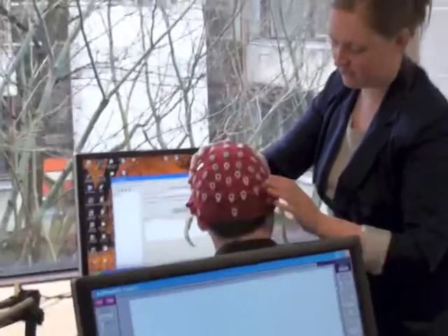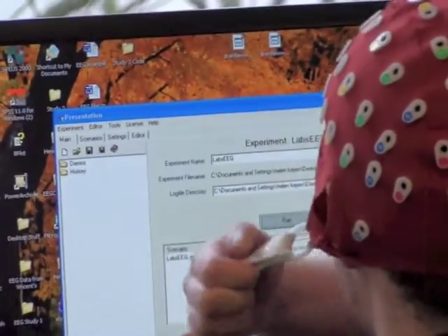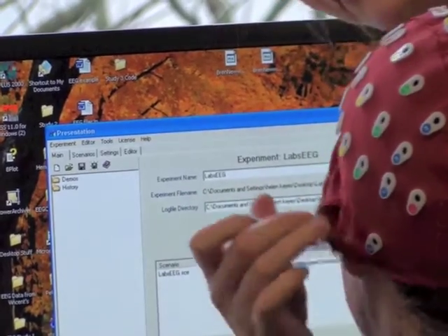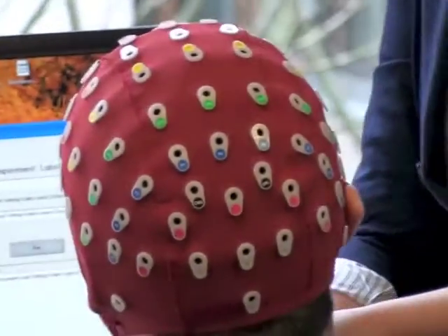There's two little ear holes, but they rarely fit people's ears, I have to say. I look a bit like a god when your ears are coming out here. Okay. And if you talk in soothing tones, it makes it easier. Is that not too tight on your chin?